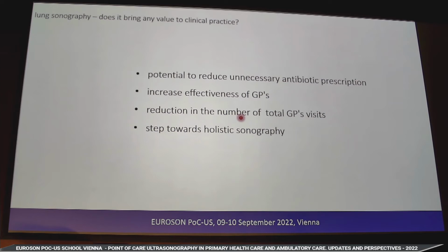And the future of lung sonography, because honestly, I think that lung sonography is the most frequently performed examination by the primary physician. The goal that we may achieve with sonographic examination of the lungs is to reduce unnecessary antibiotic prescription and increase the effectiveness of general practitioners by reducing the number of total visits.